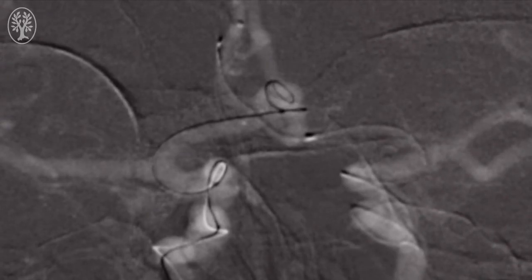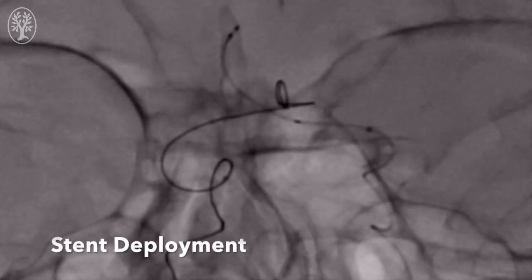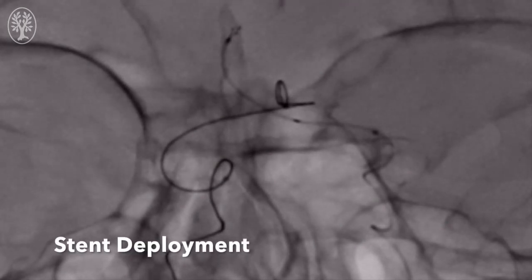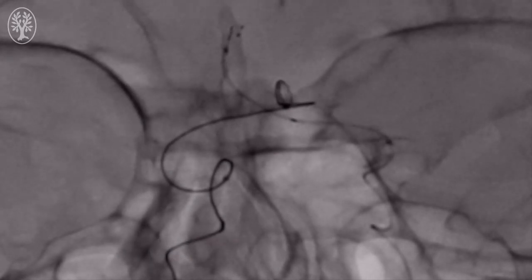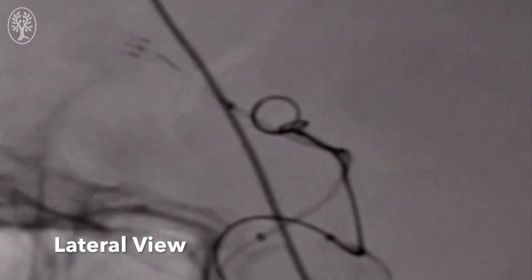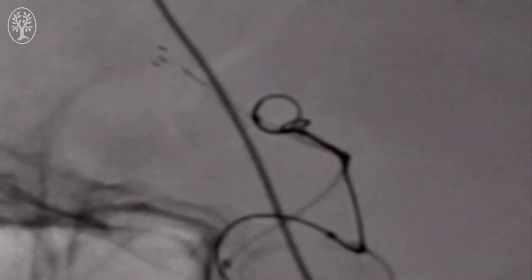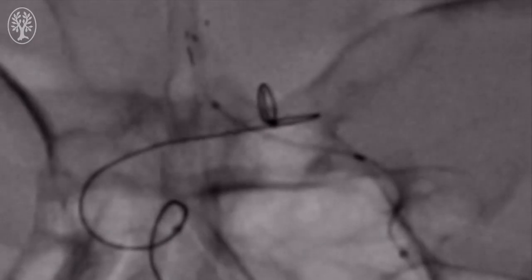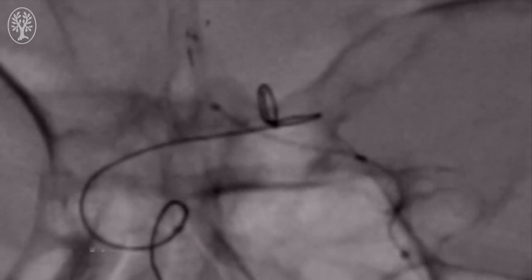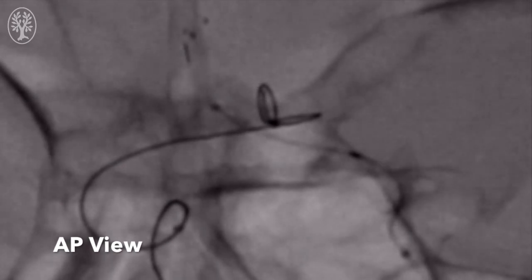Once the first coil is deployed but not detached, we now return to the left side microcatheter and unsheath the Neuroform Atlas stent. Here under high resolution microangiography, you can see the stent being deployed. Slowly we unsheath the Neuroform Atlas, try to optimize the position, and now we begin to deploy it across the neck of the anterior communicating artery aneurysm. Again, we see the coil is in the aneurysm, but it is not deployed.